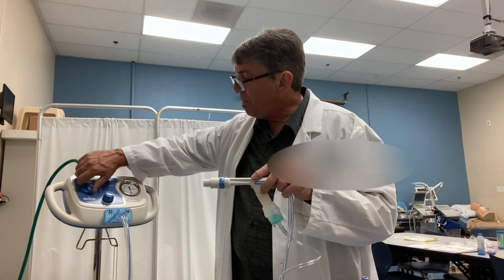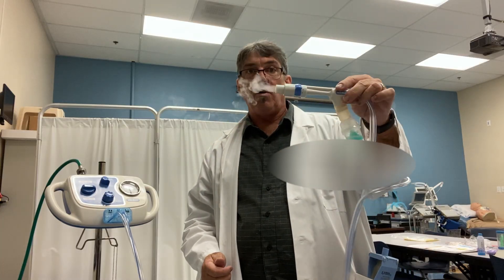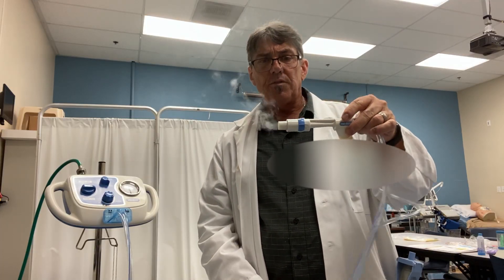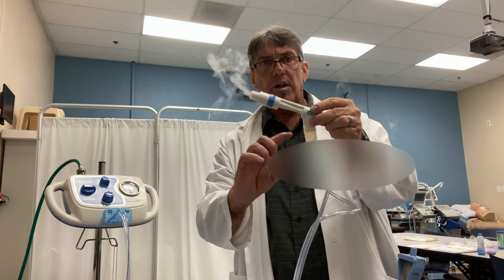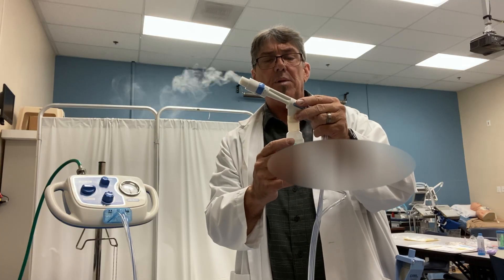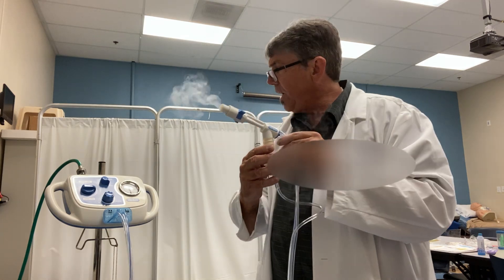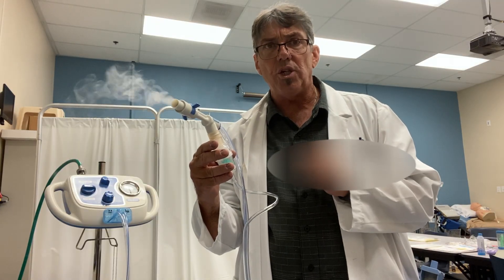The Medinab is a very useful device, new on the market, made by Hillrom. The downsides are that the circuits are fairly expensive, and most facilities will use the circuits for several days before discarding them. The nebulizers are a standard nebulizer that can be placed on this device — you can use many different manufacturers; you don't have to use a Salter Lab. I'm going to grab the camera and get a little closer to the Medinab before we conclude this session.